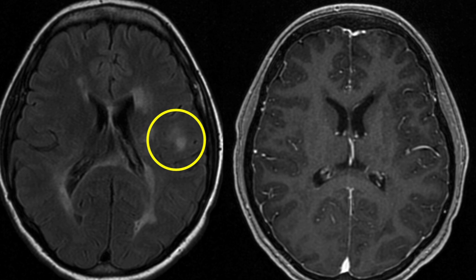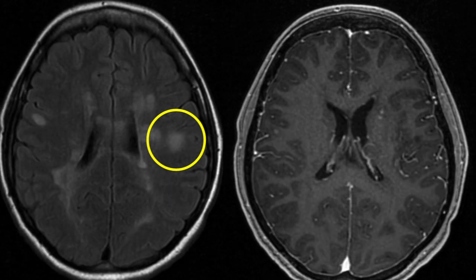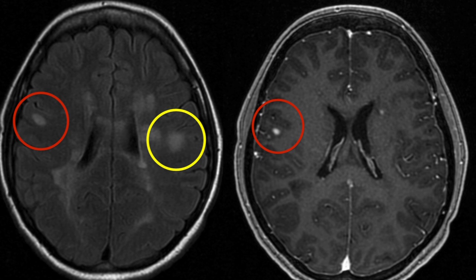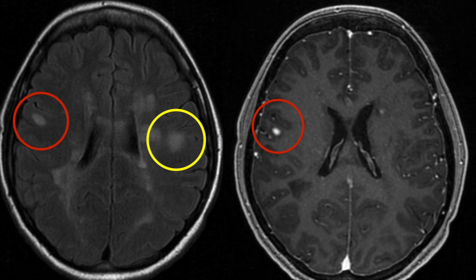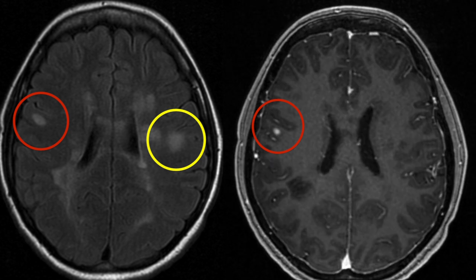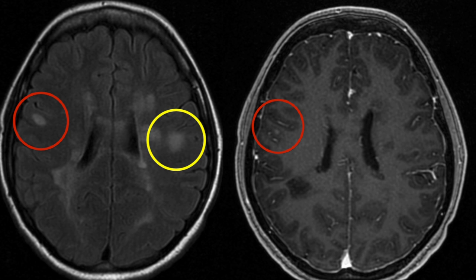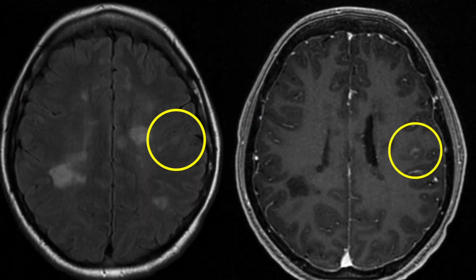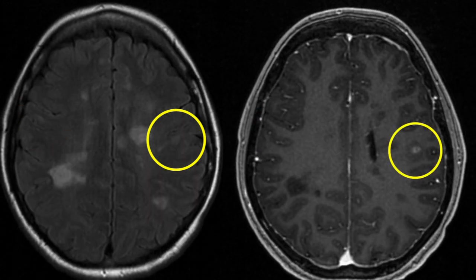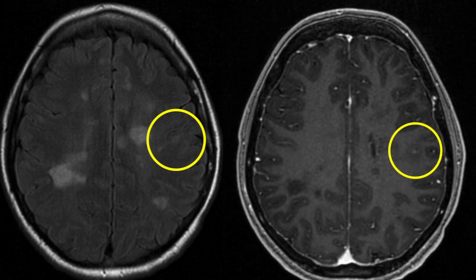As we scroll up a little farther we see two lesions — one circled in red and the other circled in yellow. When you look at the post-contrast sequence you can see that they both take up abnormal contrast. This tells us that both of these lesions are new and active.